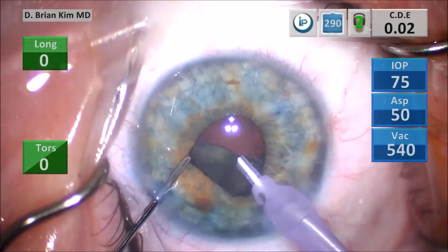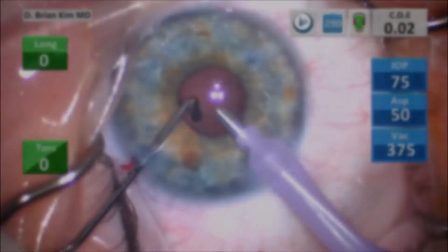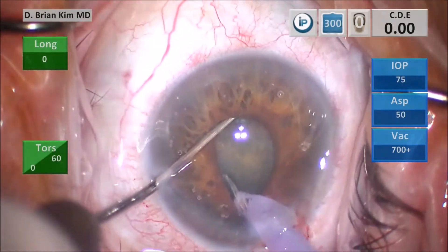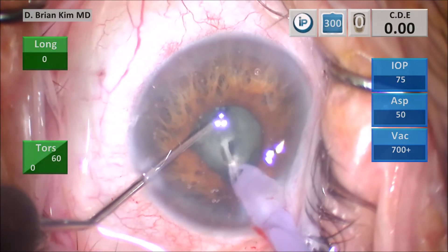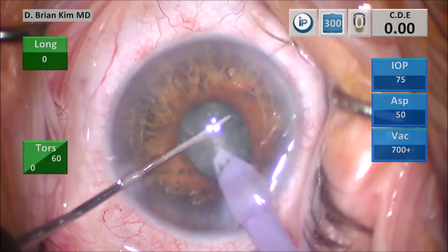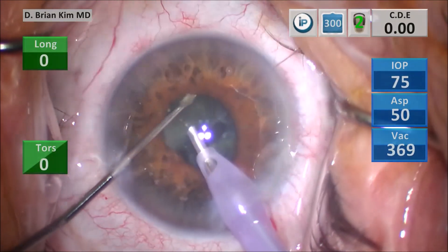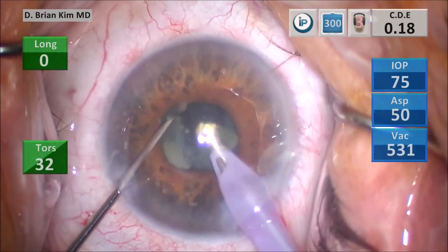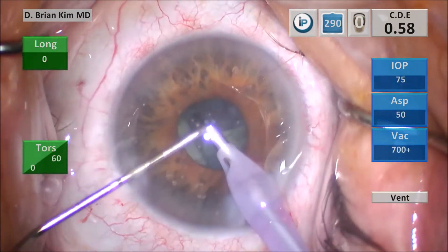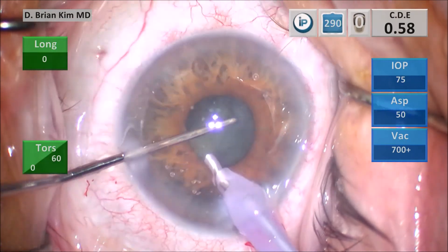You want to continue to work in the central safe zone throughout the entire case, and this technique is independent of pupil size. I'm performing the same maneuver: take the chopper out to the equator, hold it from below, push down with the phaco tip as I raise up with the chopper — both instruments meet in the middle and the lens is fractured. There's no zonular stress with this maneuver. I perform the cross chop by placing the chopper out to the contralateral equator and fracturing that lens as well. I prolapse the fragment towards the center using the chopper. This technique is nice because you're able to work in the central safe zone even with a smaller pupil — the technique and movements are still the same.